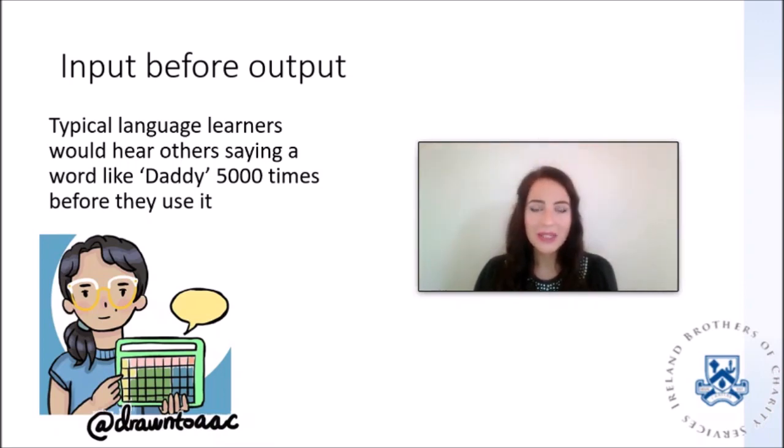When we teach language in a way that makes communication feel like work or a demand or a test, some language learners may shut down, or some might try to exercise a little bit of control by not responding. We want to make sure that we're reflecting and pausing and asking ourselves often, am I modeling language and focusing on interaction, or am I testing language? We want to make sure that we're modeling, teaching language, focusing on interaction, and making it fun for the language learner.